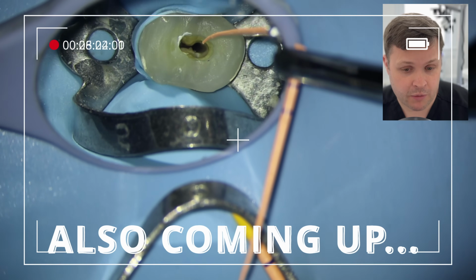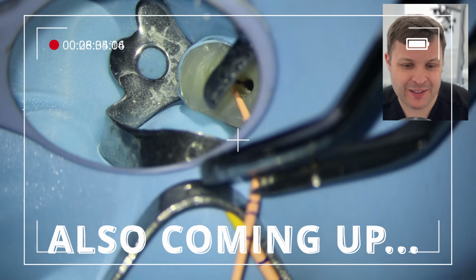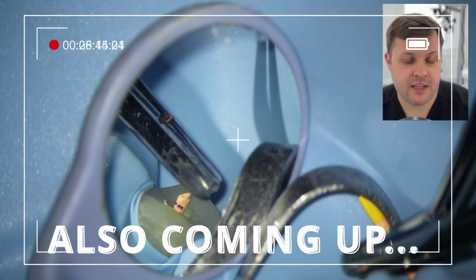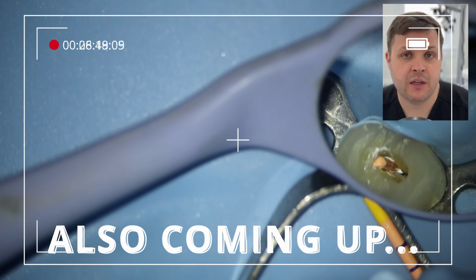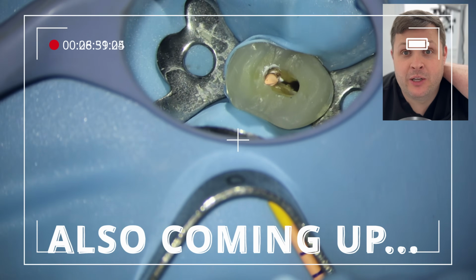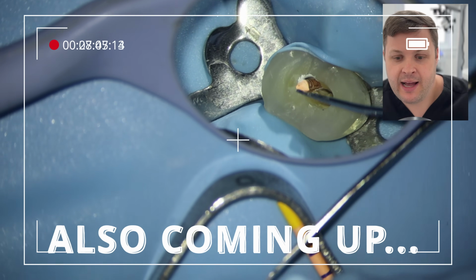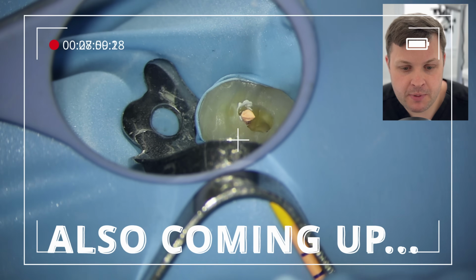which I think is the buccal canal. I start to place this GP cone in the buccal canal, and the first thing I notice is that this is going really, really easily. In fact, I think that this GP cone is going past or beyond the mark that we've made. What I've realized is that I've picked up the wrong cone for the wrong canal. So this is actually the palatal GP cone. So I am going to very, very carefully and quickly remove this GP cone.